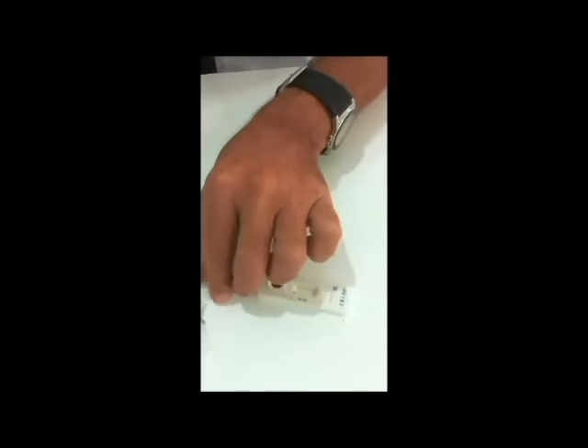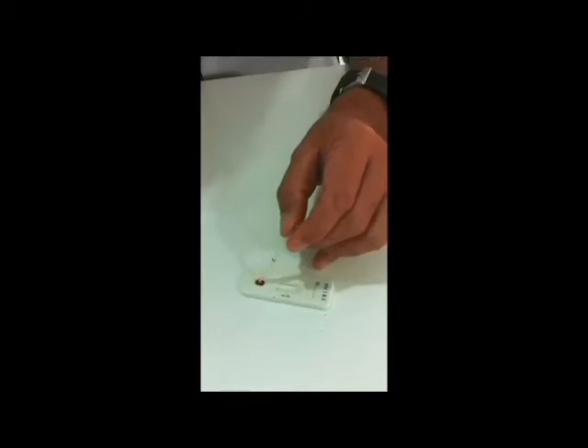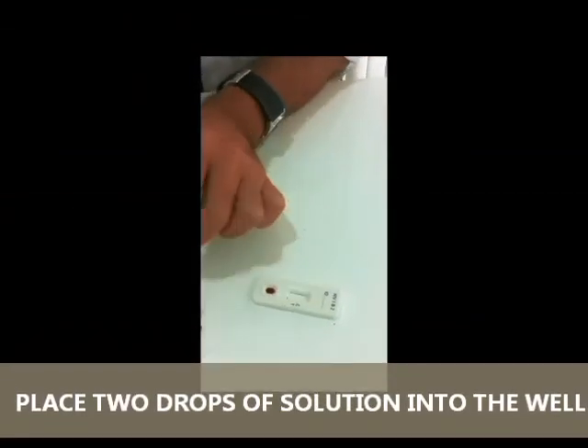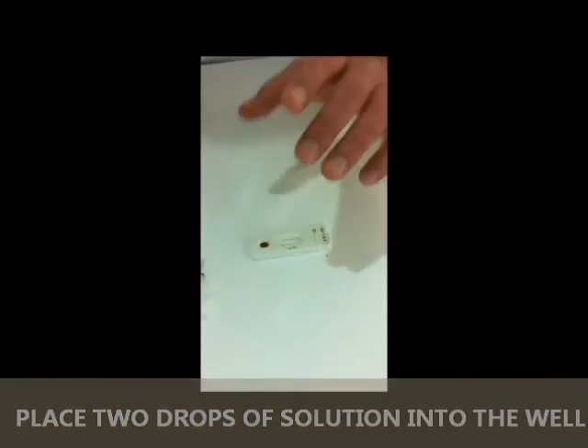Once you've done that, you then get the buffer and drop it in here, which activates the test. One or two drops will do in this case. What the buffer will do is dilute the blood so it heads up towards the test.